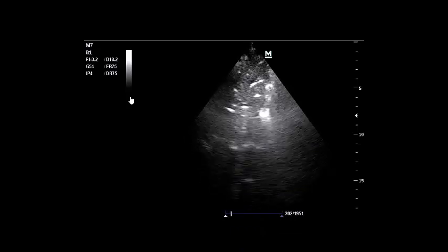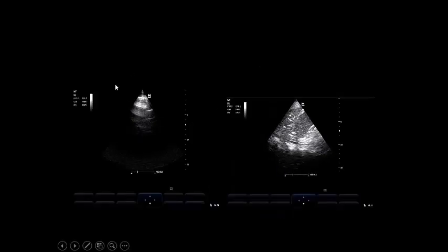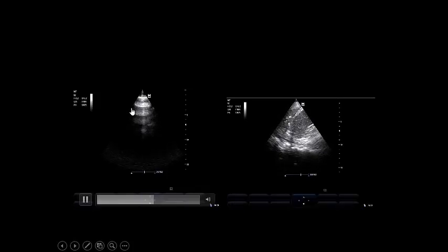What else? This is the normal lung: A-lines, transverse lines all over. This is the pneumonic lung. It is similar to an organ, like a spleen or liver. It will become like spleen or liver: hepatization. This echogenic cord is the diaphragm. This is the spleen, and this is the pneumonic lung. You see here, it became an organ, not lines.